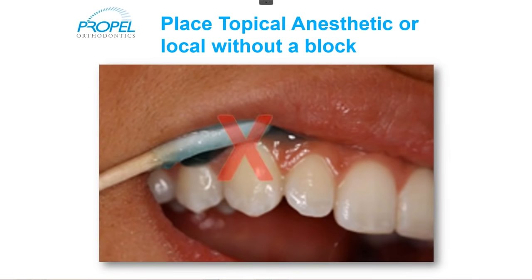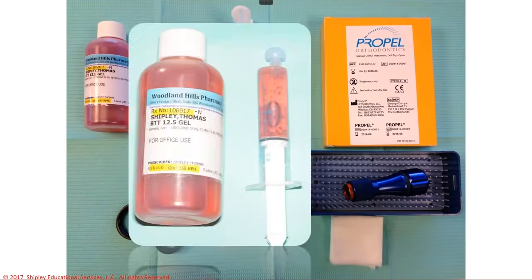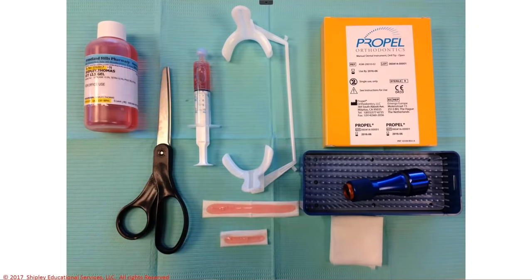This is not how I place topical. This is my tray setup for placing topical. I'm not going to squirt the topical or the BTT directly into the patient's mouth. I'm going to squirt it onto these gauze strips. We're going to put an ample amount on. This would be the length for 5 to 5. This would be the length for 3 to 3. We're going to put the cheek retractors in the mouth and then lay the tissue on the gums depending on how many teeth we need to numb up.